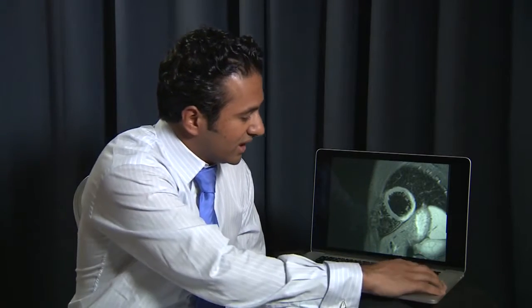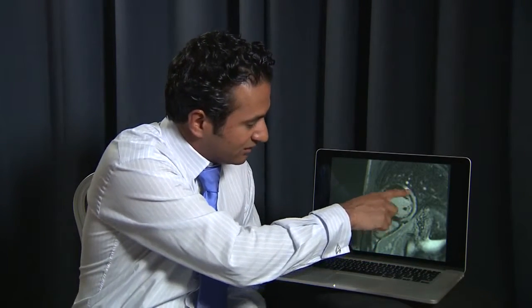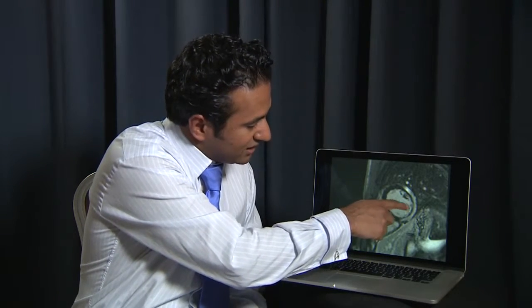Now we need to know: has he had a heart attack? How can he have had a heart attack if his coronaries are normal? When we give contrast, we can see there is a lot of scar, but it is sparing the inner part of the myocardium and affecting really the outer part. This is an inflammatory cause — this is myocarditis, an infection that affected the heart. Even though coronary arteries are normal, we can't absolutely exclude a heart attack, but in this case the cause was myocarditis, not a heart attack. Cardiac MRI is probably the only investigation that can distinguish between the two.